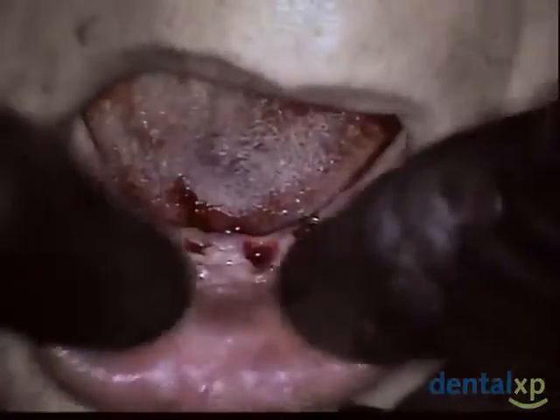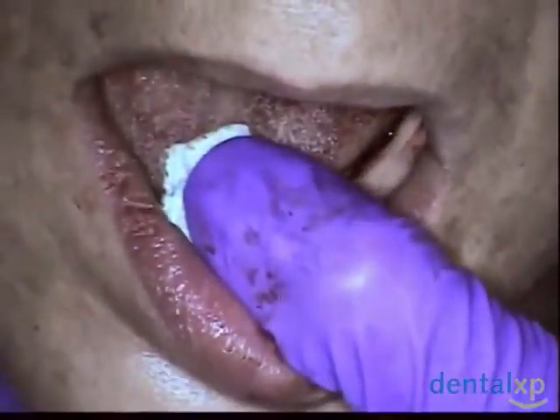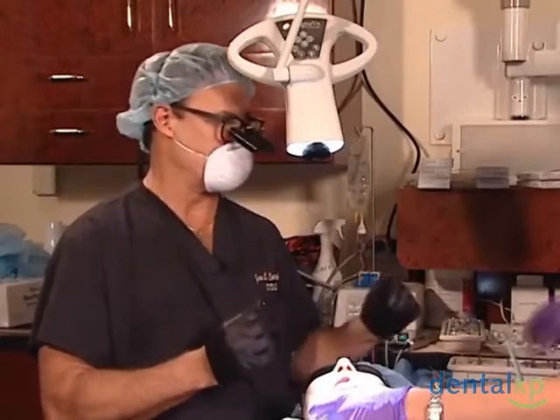Why am I placing my primary implants first? Because they're going to expand the bone a little bit. When I place a 2.2, it's going to be pretty snug. I prefer not to tap that if I don't have to. So if I've expanded that bone, that may preclude me from having to go back in and tap in that specific site.